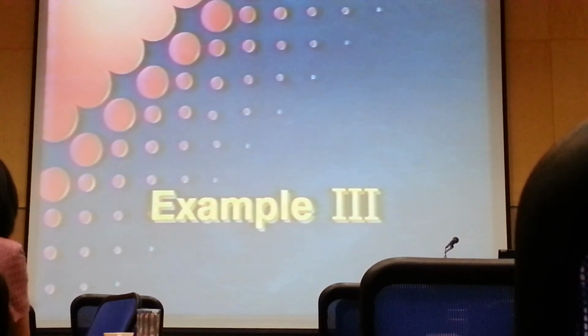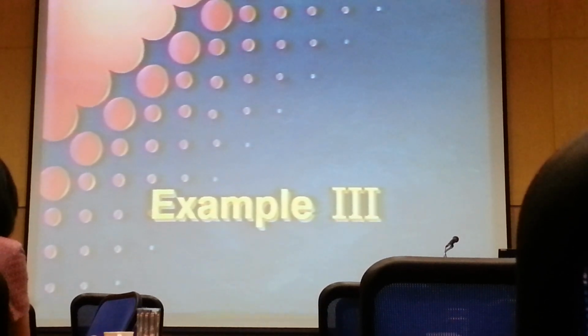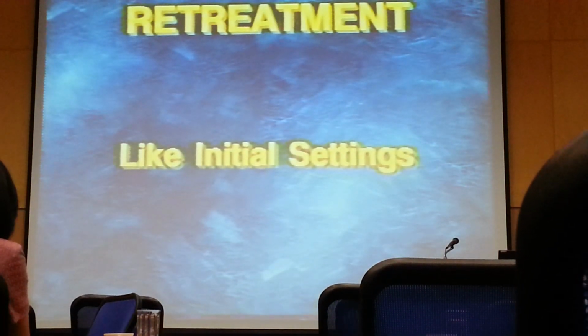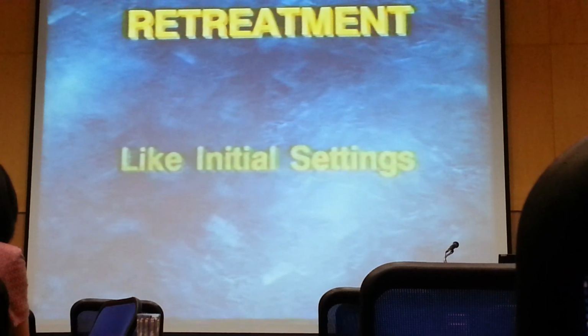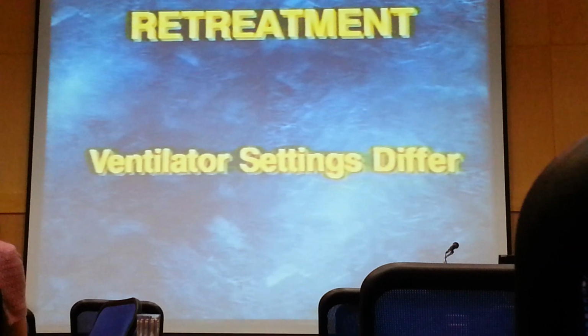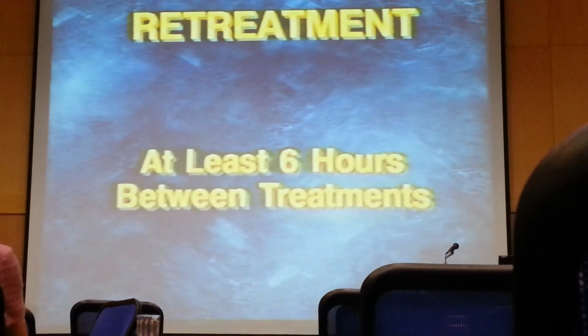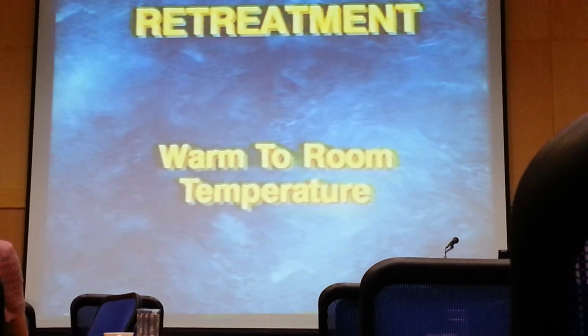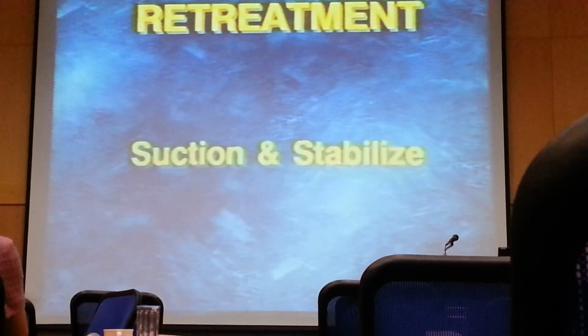This infant will again be treated through a neonatal suction adapter. Retreatment with Surfactant is virtually identical to initial dosing procedures. For all infants, however, ventilator settings may differ slightly. At least 6 hours is required between treatments. Before retreating, warm the drug to room temperature.